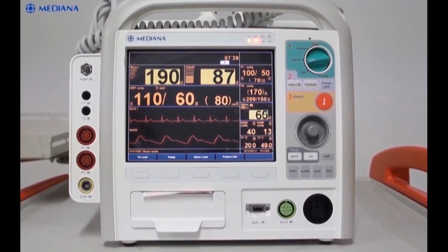And at last, let's briefly cover the maintenance of the device. The D500 may be surface cleaned by using a soft cloth dampened with a commercial non-abrasive cleaner, quaternary ammonium, 70% isopropyl alcohol, 10% chlorine bleach solution or PDI Sani-System. Lightly wipe the top, bottom, and front surfaces of the D500. The cleaning method for paddles and paddle plates are the same as for the D500.